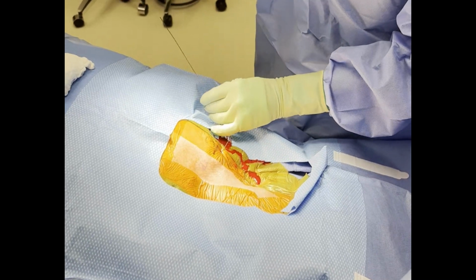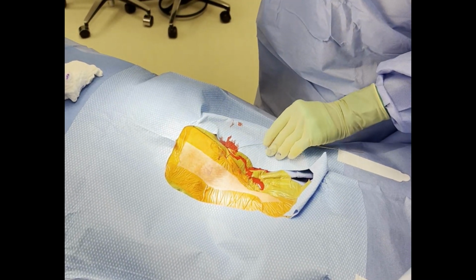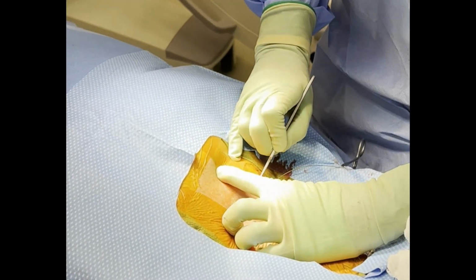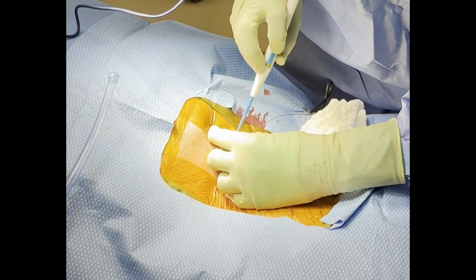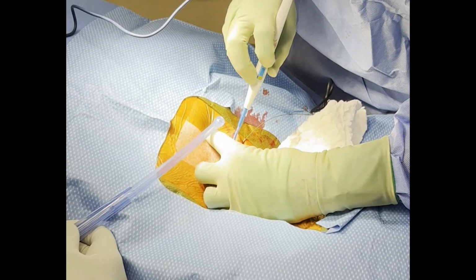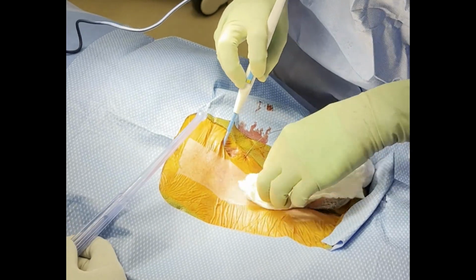Once you confirm accurate placement of the guide wire, secure it if you're not handling it to ensure that it does not embolize. Now that the guide wire is in place, it's time to create the pocket where the port will sit. Make a 2 centimeter incision just inferior to the guide wire site and dissect down to the chest wall, which will be the pectoralis major.